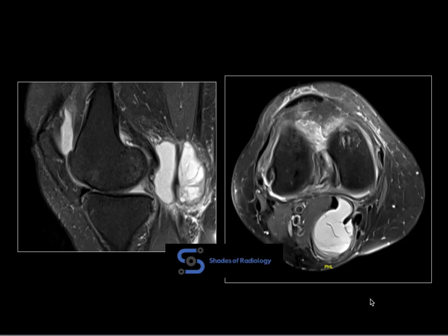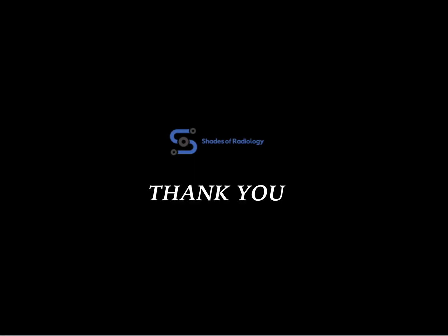Classic one — a simple cyst from the popliteal fossa with classic appearance of neck and body, located between the medial head of gastrocnemius and semimembranosus tendons: classic Baker's cyst. It has a thin communication with the knee joint. Sometimes it may not have a communication, in which case we call it gastrocnemius-semimembranosus bursitis. Thank you all.